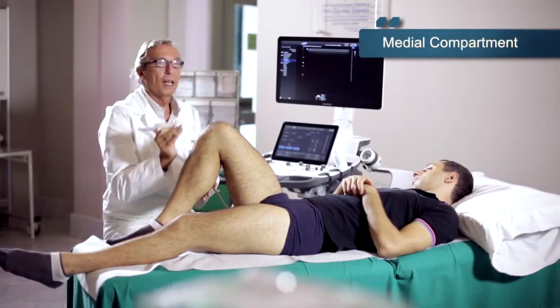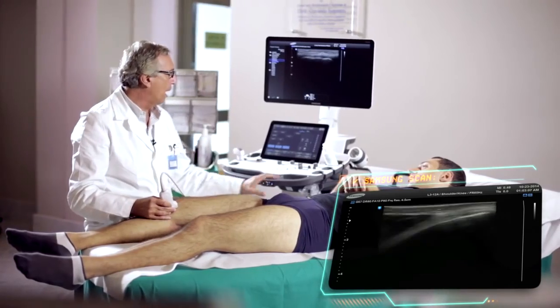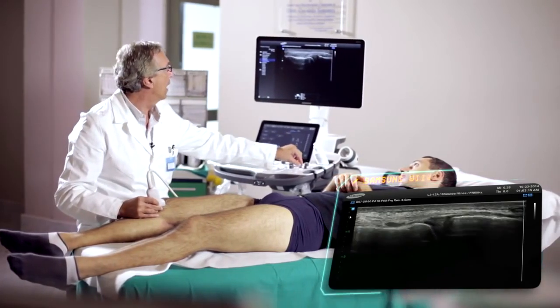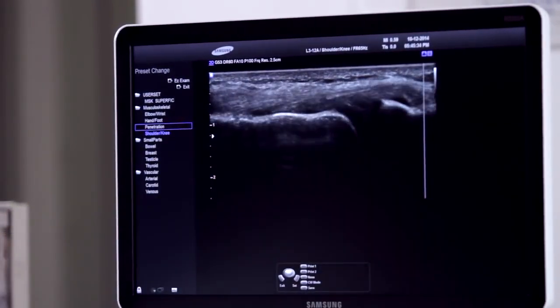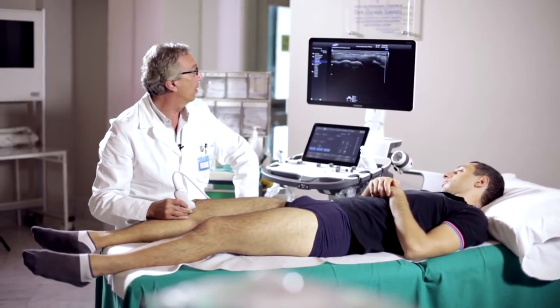After this, we evaluate the anatomical components of the medial compartment of the knee. We will try to analyze one of the most important, which is the medial collateral ligament. As you know, this ligament has a peculiar morphology and anatomy, and it is made by two components. A surface component, which we can see in the image, and this is characterized by a ribbon-like structure that covers the medial compartment, and a deeper component, meniscus femoral and meniscus tibial, which accounts for the complexity of this ligament.